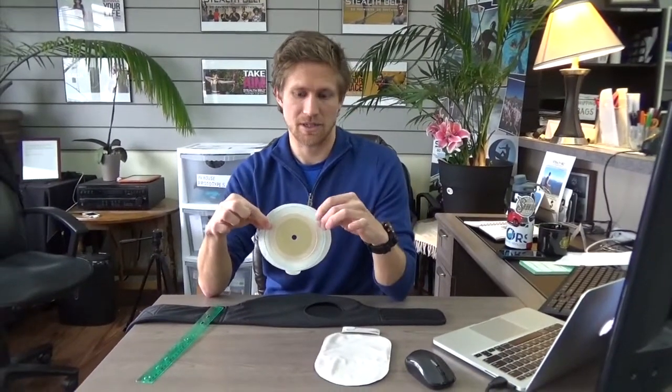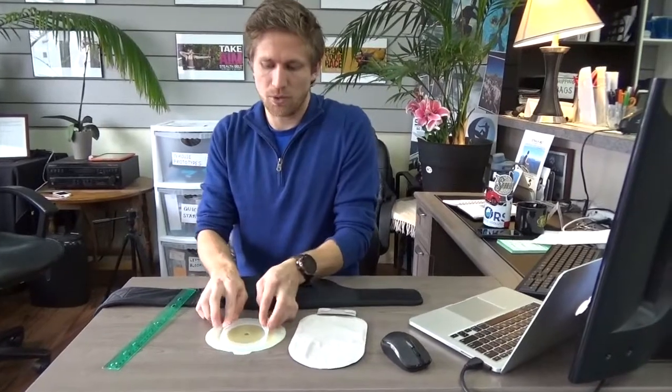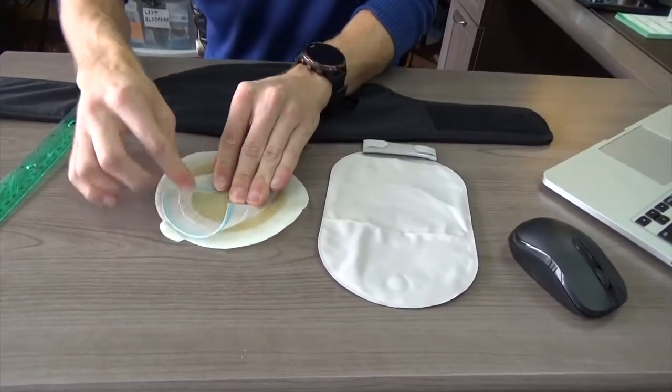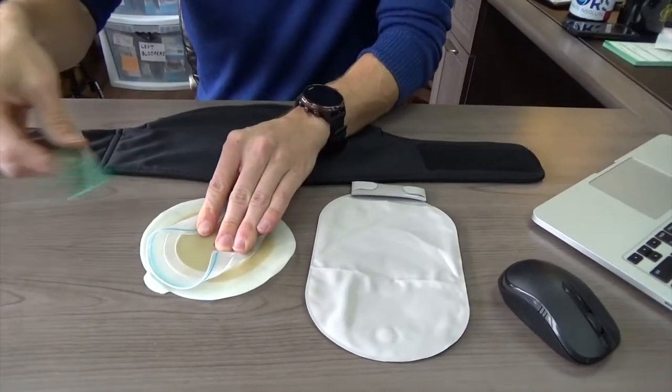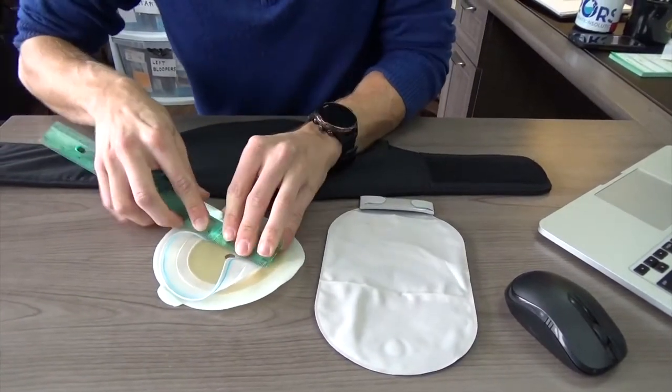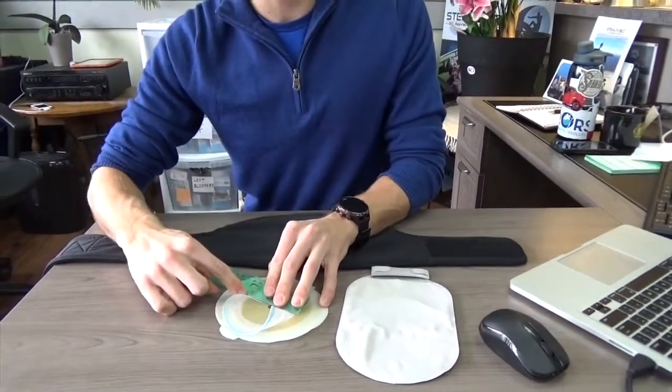I'm going to measure this piece so you can see how it's done. You want to fold the sides of this top part in towards the middle and measure from the connection point across. This particular appliance measures at about three inches, which means for our belts you'll want to order a three and one quarter inch belt.